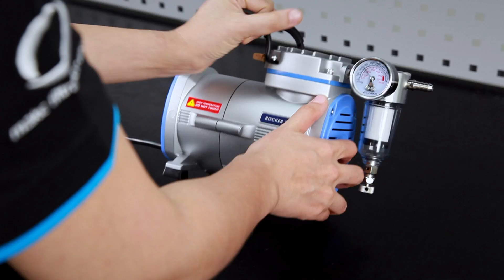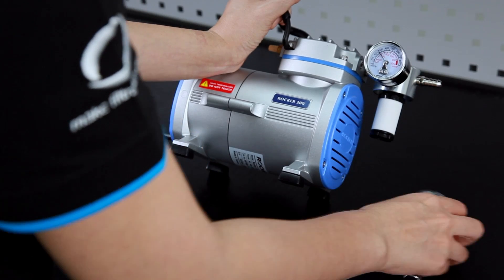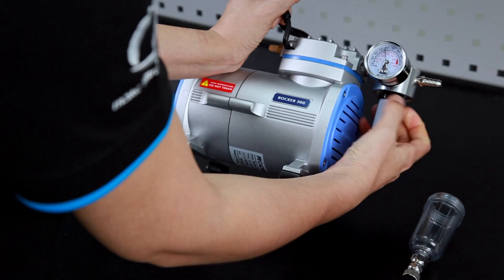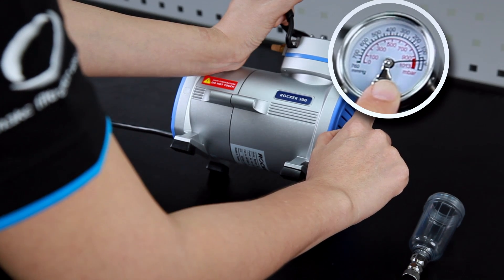First, remove the moisture trap and take the filtered cartridge out. You may notice that the vacuum level has resumed.